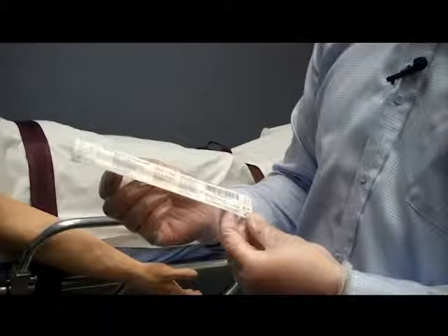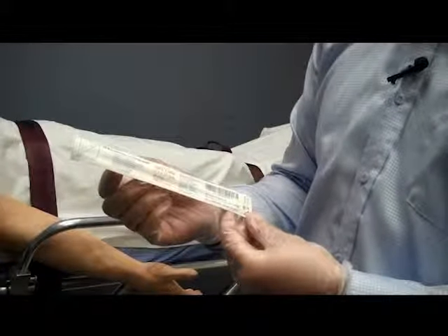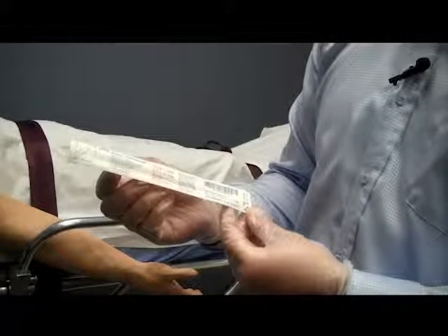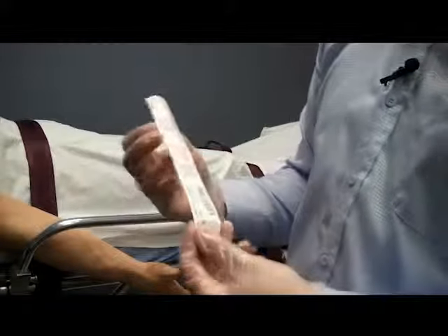Next I will check the catheters I will be using. I want to make sure the packaging for the catheter is intact with no rips or openings. Also check the expiration date. Make sure this is the proper size needle and catheter based on the patient's condition.